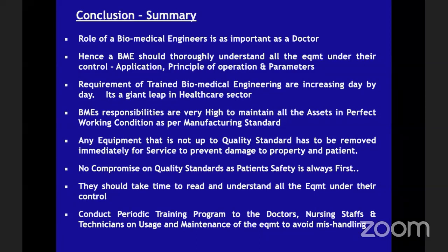So very important. Any equipment that is not up to the quality standard should be removed immediately from service to prevent damage to the property and to the patient. Remove the machine immediately from the department. Take it to your department, leave it over there, and see what is the fault. No compromise on the quality standard and patient safety.